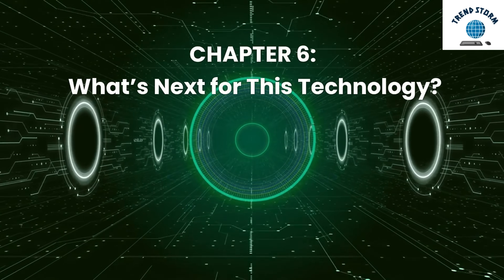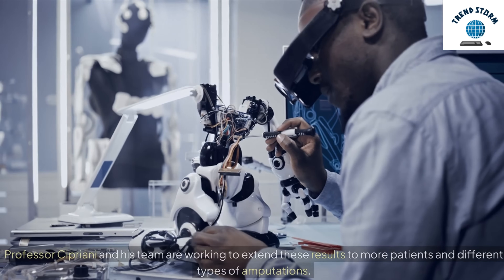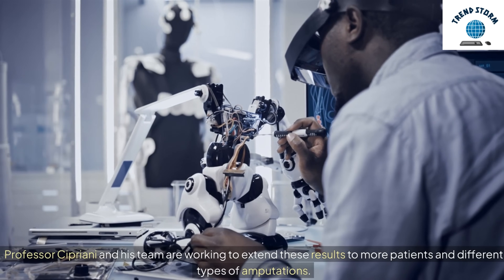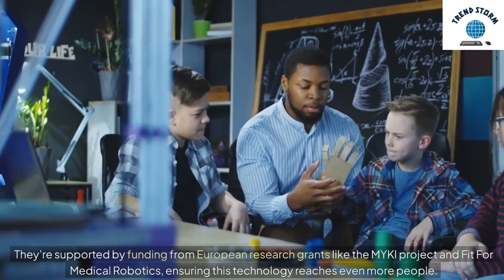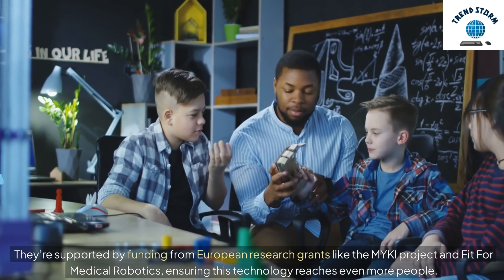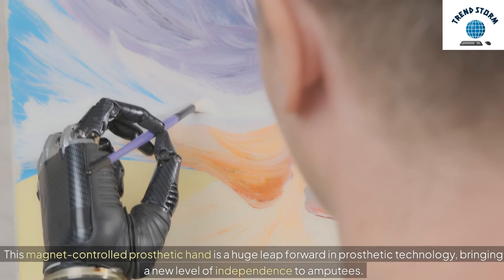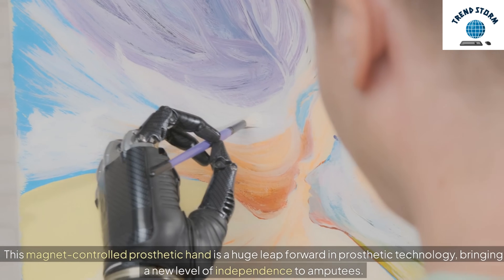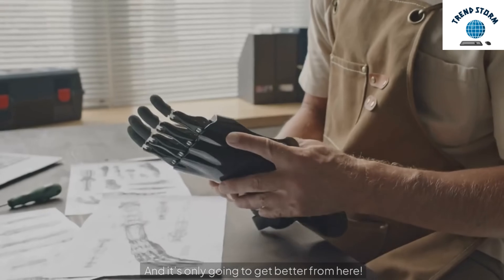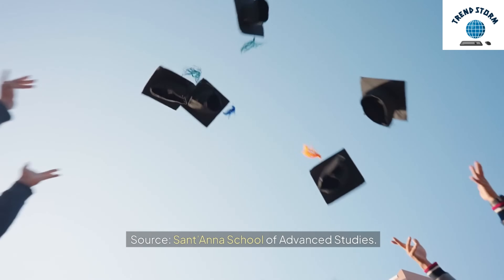This trial is just the beginning. Professor Cipriani and his team are working to extend these results to more patients and different types of amputations. They're supported by funding from European research grants like the MYKI project and Fit for Medical Robotics, ensuring this technology reaches even more people. This magnet-controlled prosthetic hand is a huge leap forward in prosthetic technology, bringing a new level of independence to amputees — and it's only going to get better from here. Source: Sant'Anna School of Advanced Studies.